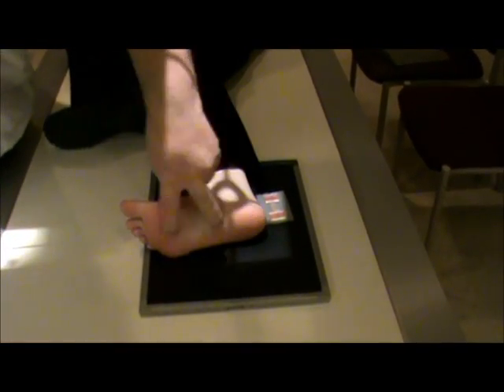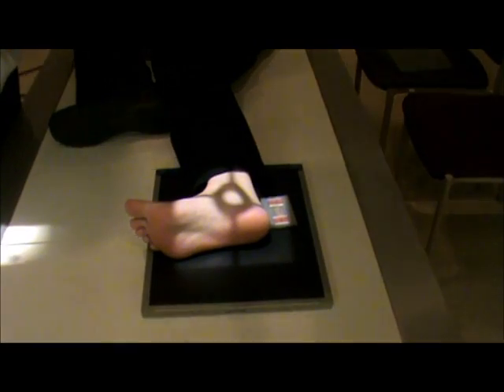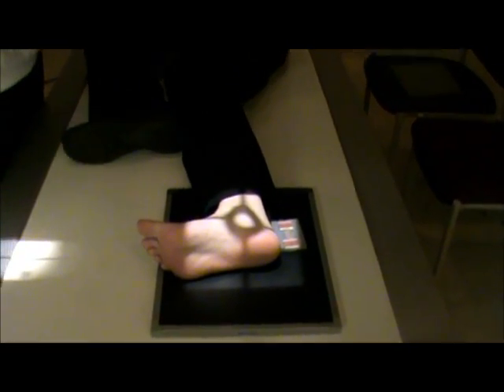We have plenty of room here for our marker placement. The foot is perpendicular to the IR as we need it to be. The technique is actually going to change and be a little different — it's going to be about 55 kV at 8 mAs. On the angled projection we need a little more because you're going through more of the calcaneus, but in this lateral position we go down a little because there's not too much tissue on the heel, and we want to make sure we don't black it out with too much technique. And these will be our calcaneus views for the heel.